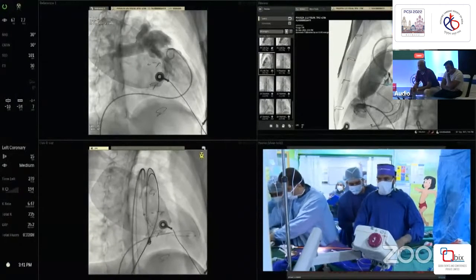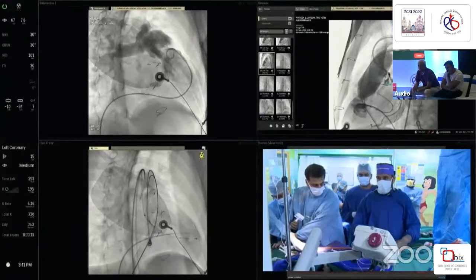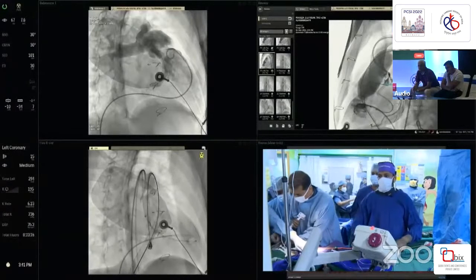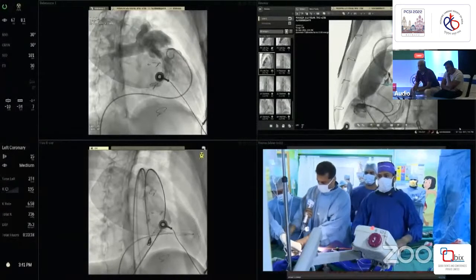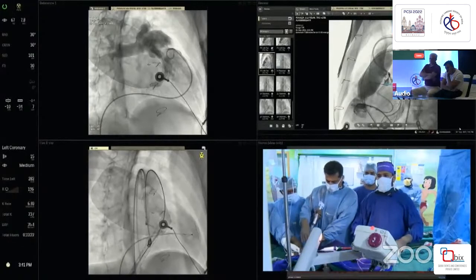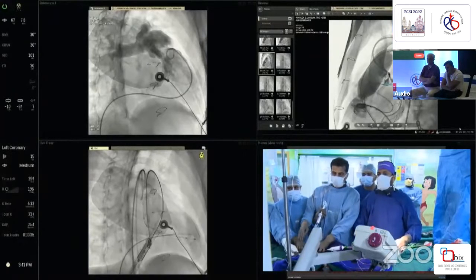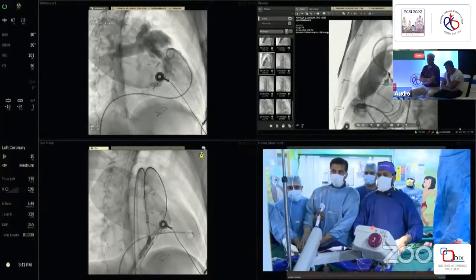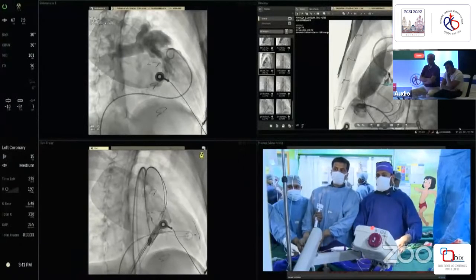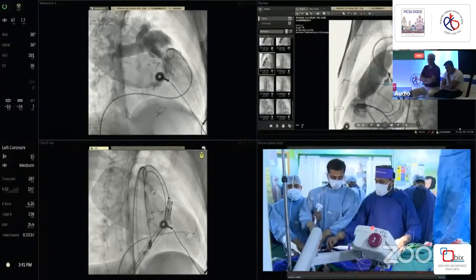Okay, going in. Valve is approaching. Now you can push it out. Can take the pusher out. Okay. Right, coming the valve. Sir, I'm holding the wire. You can go ahead. Okay, ready? Ready the injection, guys? Wait, we take the other wire out. You go up, sir. Just go up and then we take the wire out. Okay, we are across. Other wire out, please.